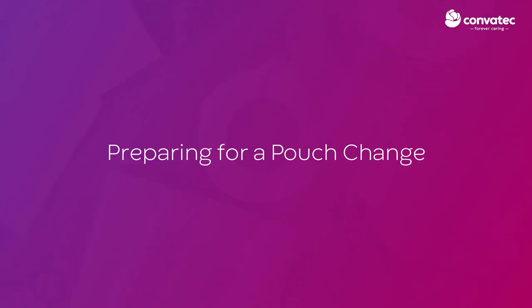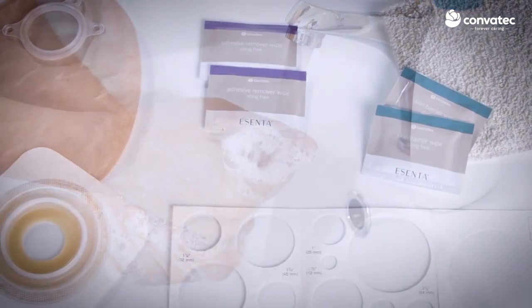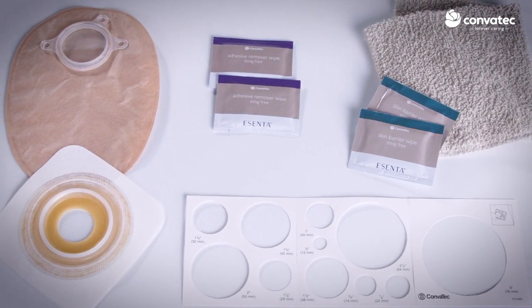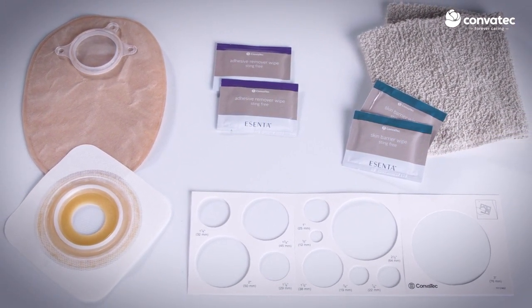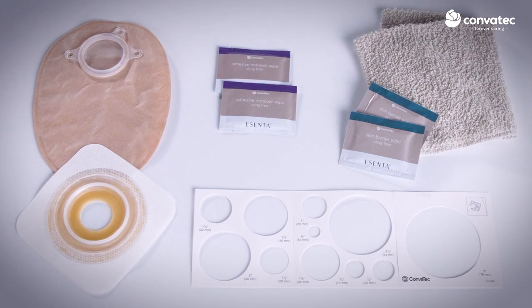Before handling your stoma products, wash your hands well with soap and water. You'll then need to make sure you have the following items: your base plate and pouch, a stoma measuring guide, a clean washcloth, adhesive remover wipes or spray, barrier wipes or spray.